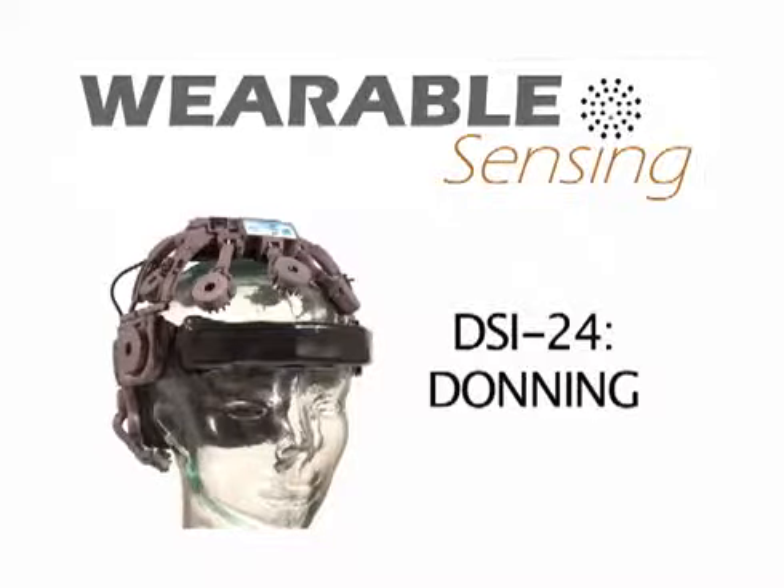This video shows the donning process for Wearable Sensing's DSi24 EEG headset.